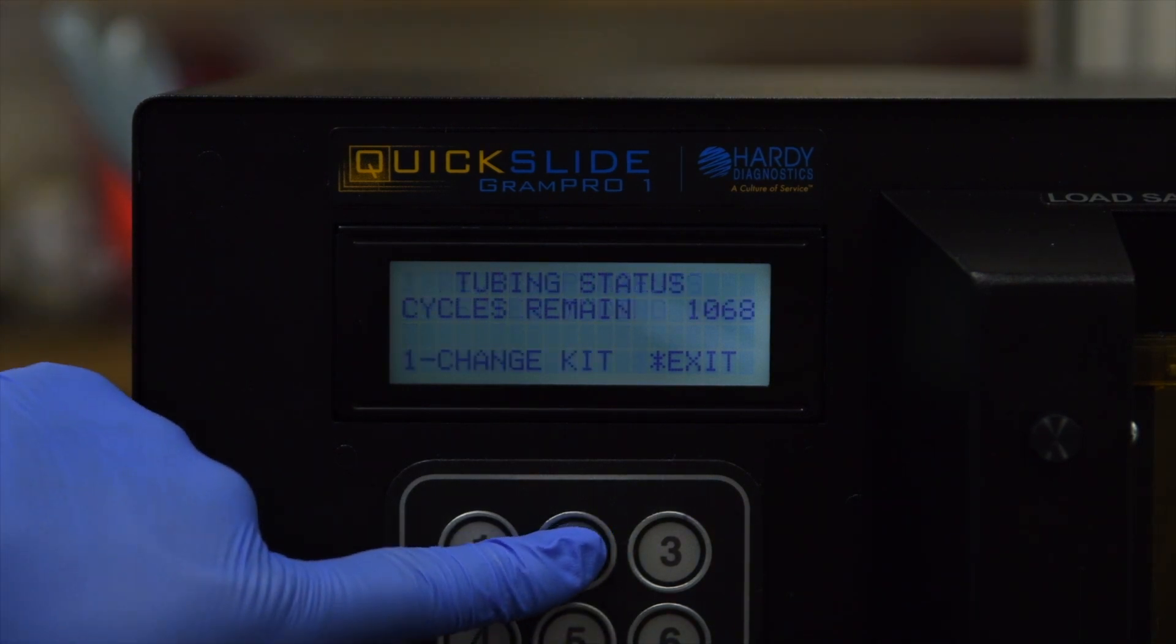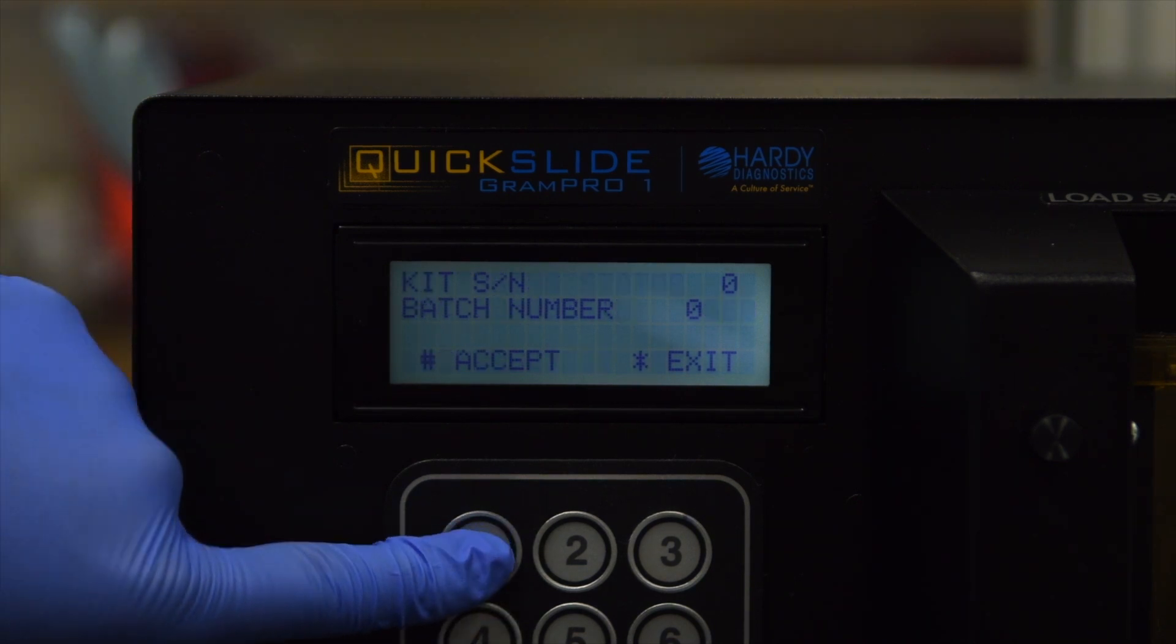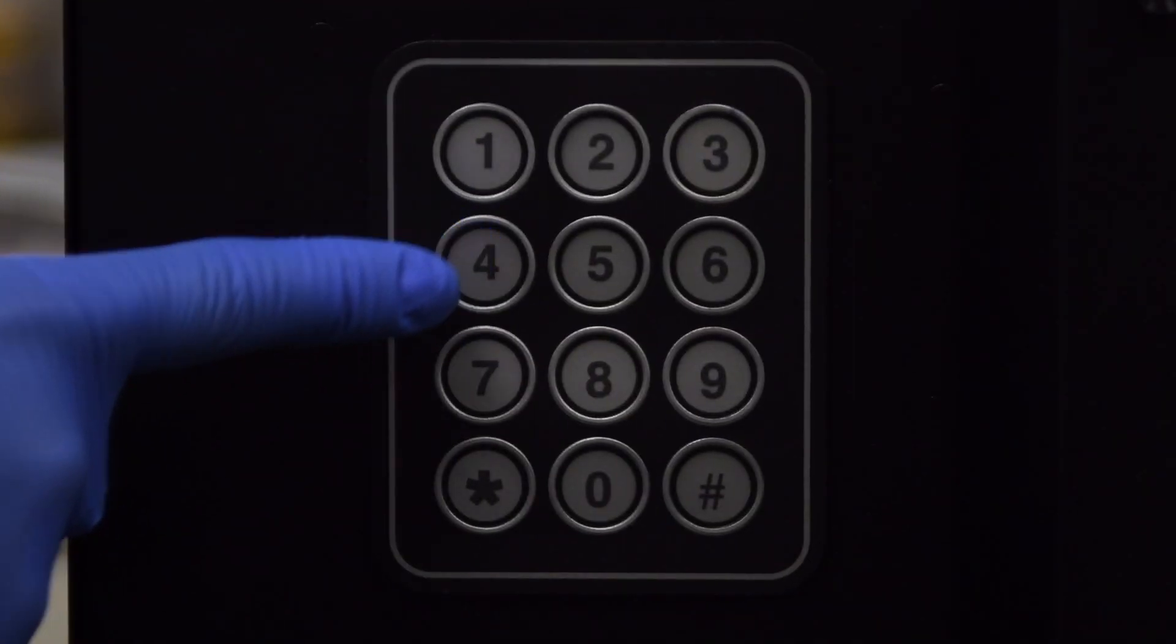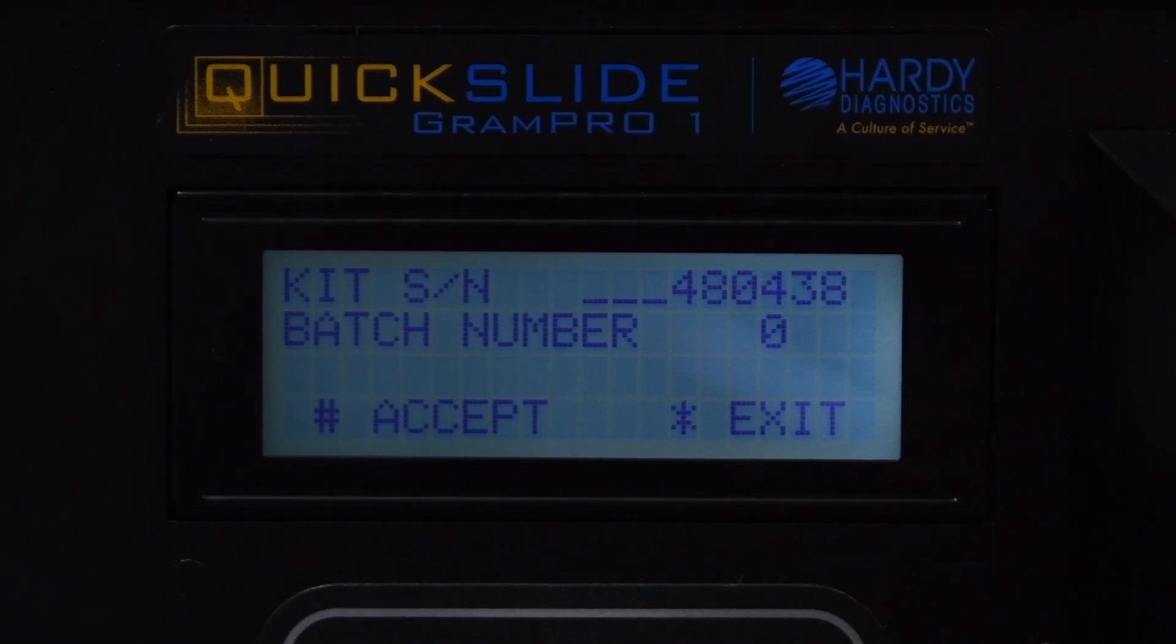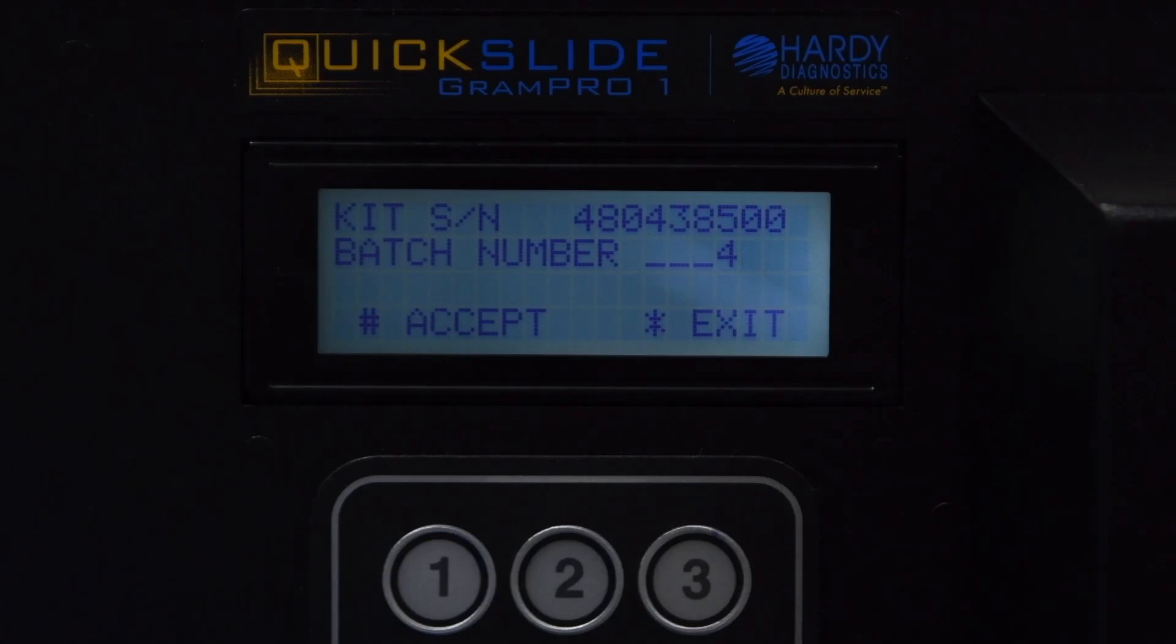Press 2 again to select Review Tubing. Press 1 to select Change Kit. Enter the kit serial number and press the pound key to accept. Enter the kit batch number and press the pound key to accept.